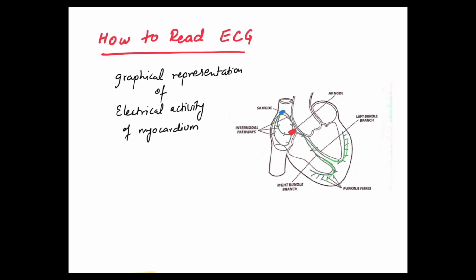It is really important for us to know that, as through an ECG we can look for an ACS, which is an acute coronary syndrome, that can indicate like myocardial infarction, angina, cardiac arrest. We can look for the electrolyte abnormalities, for example hypercalcemia or hypocalcemia or hyperkalemia or hypokalemia, which is potassium or calcium level, and others as well.